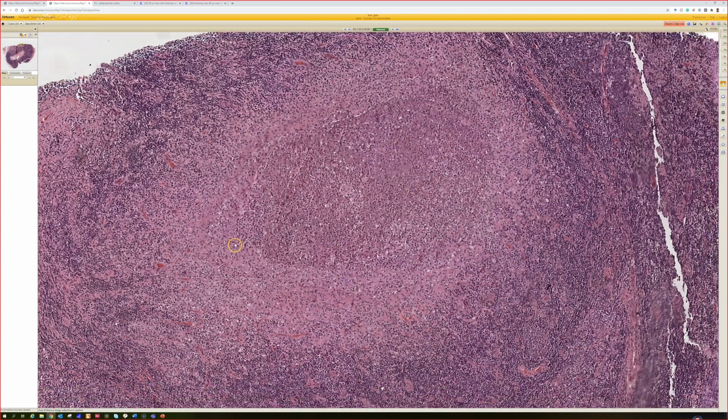And you can sometimes see this in the skin itself, particularly at the site of a cat scratch, like an infected cat that scratches someone. They may get the swollen node, but also they may get some granulomatous response like this in the skin. I believe some people have called that Bartonella inoculation site changes, that it's like getting that same response right where the cat scratch occurred.